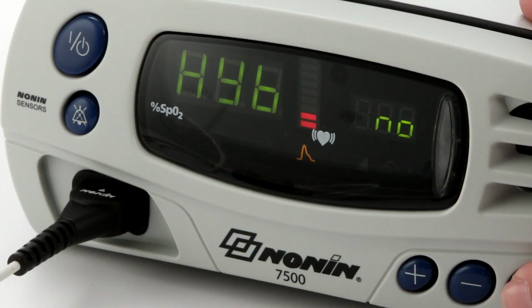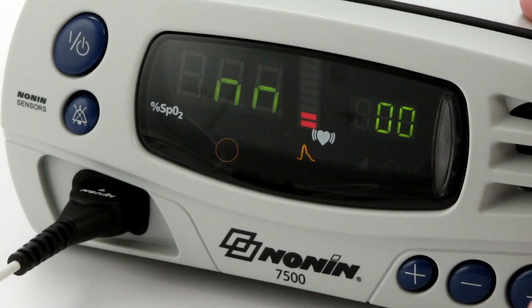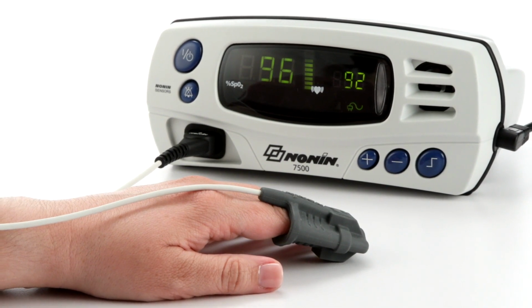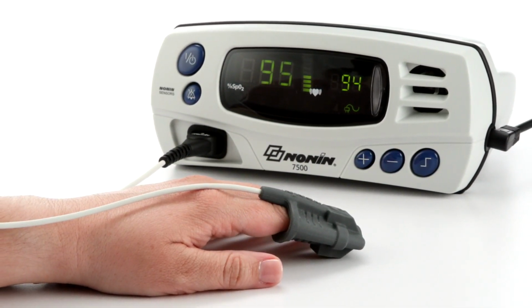If alarms are enabled, they will remain silent for 2 minutes at startup to allow time for sensor placement or setting adjustment. Check the oximeter's time settings for accuracy during the startup. Reset the oximeter in setup mode if they are not accurate or appear as zeros. After the startup sequence, the oximeter will start displaying and recording SpO2 and pulse rate as soon as the sensor is placed on the patient.